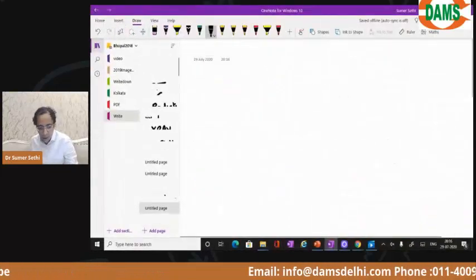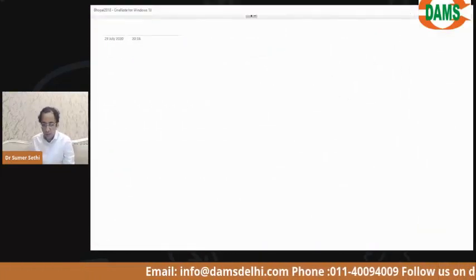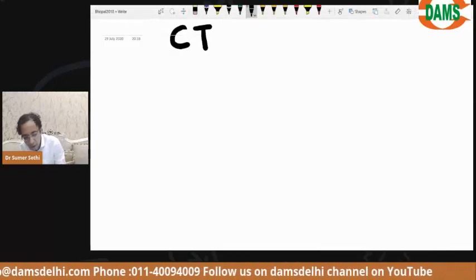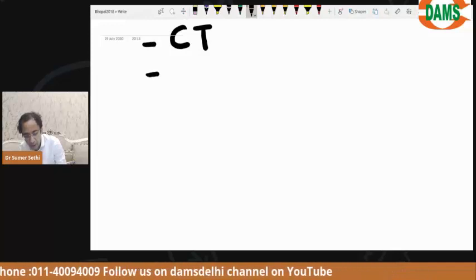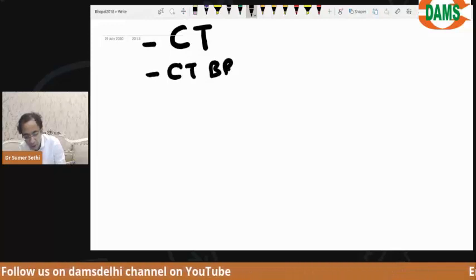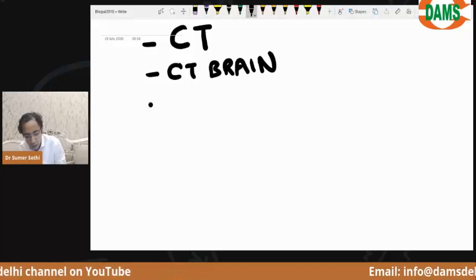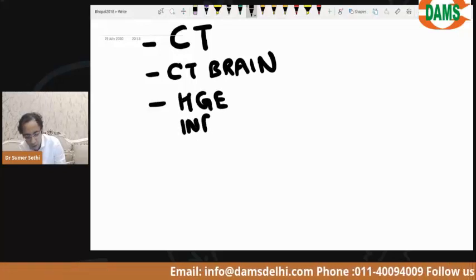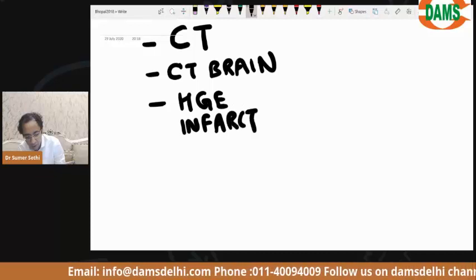So let's recap what we have done so far. What I told you today was I taught you the basics of CT scan. Then I showed you the CT brain anatomy. I taught you how to look at brain hemorrhage and brain infarct, including the arterial infarct, venous infarct.